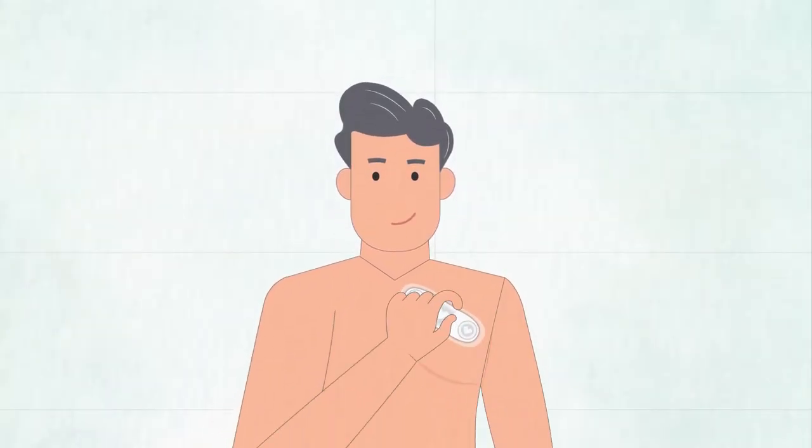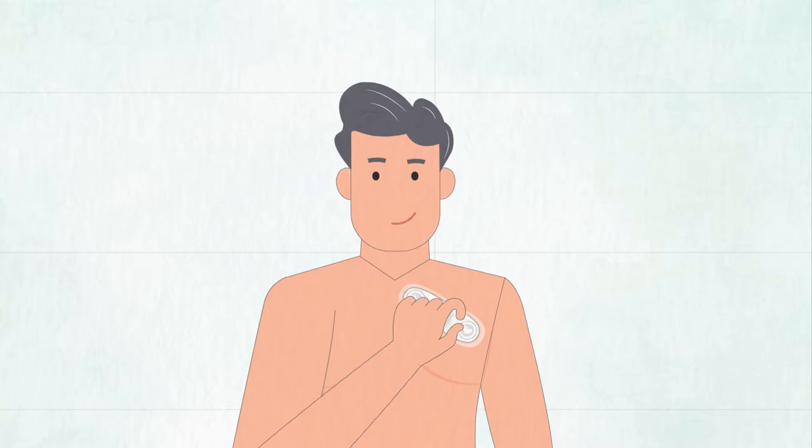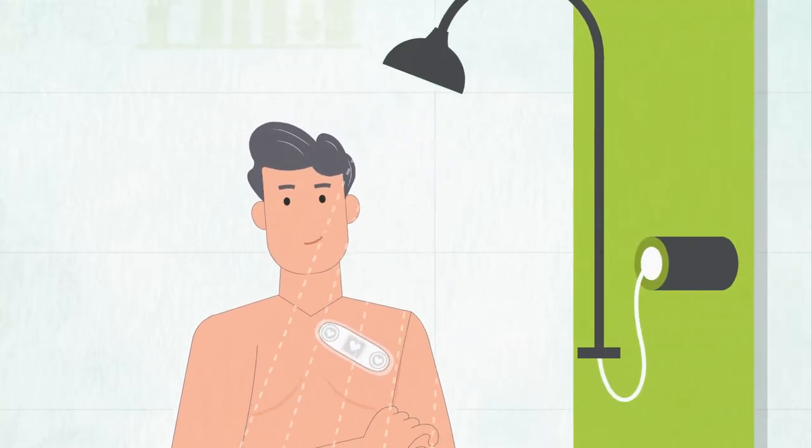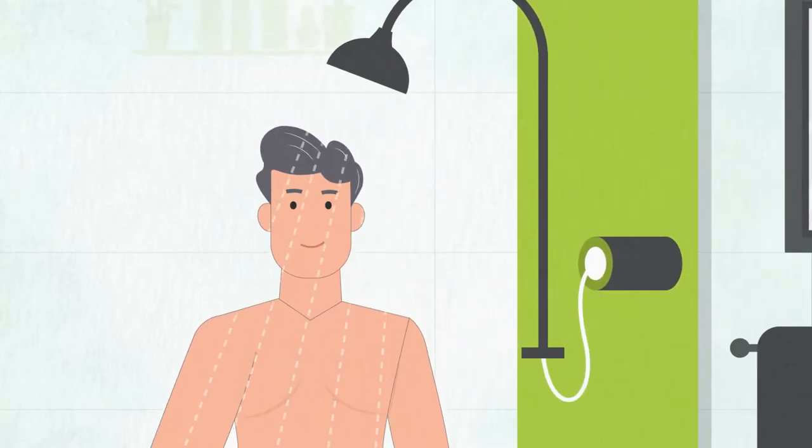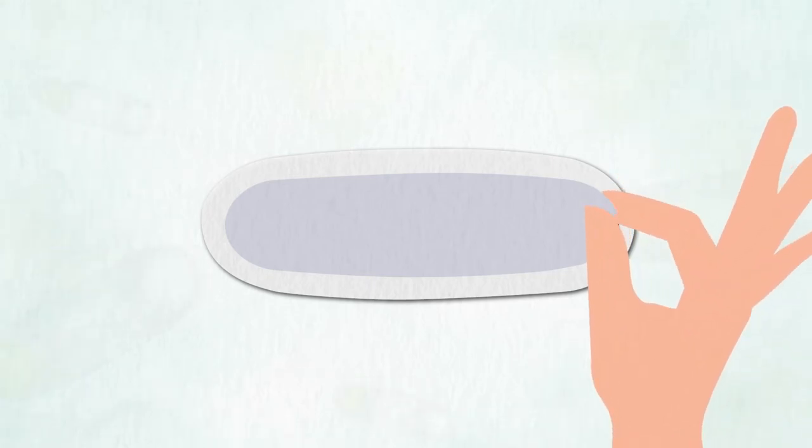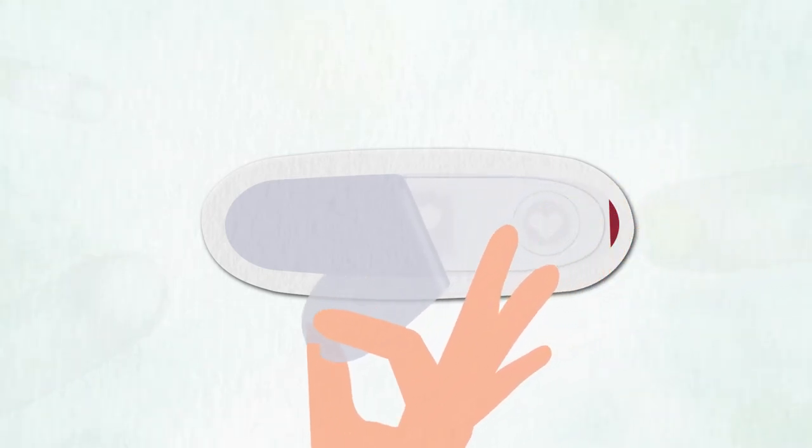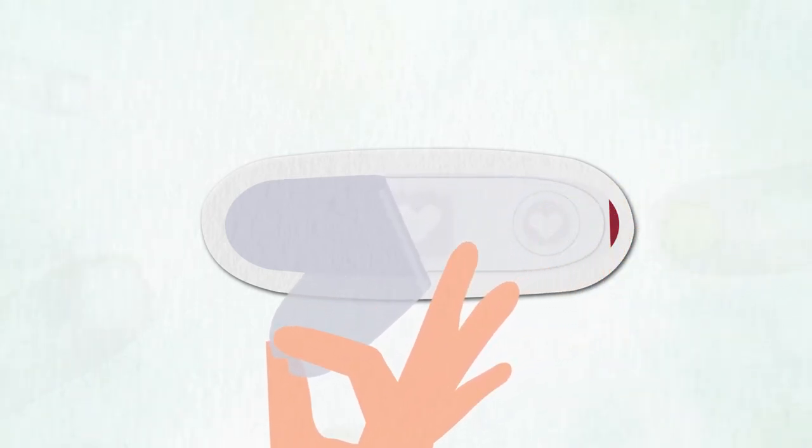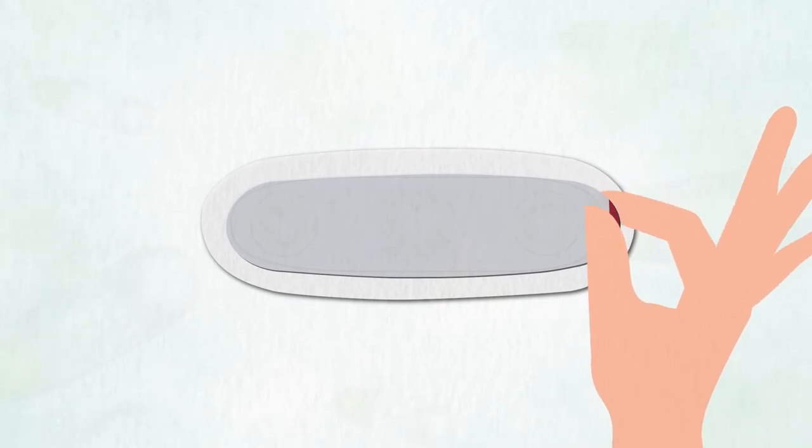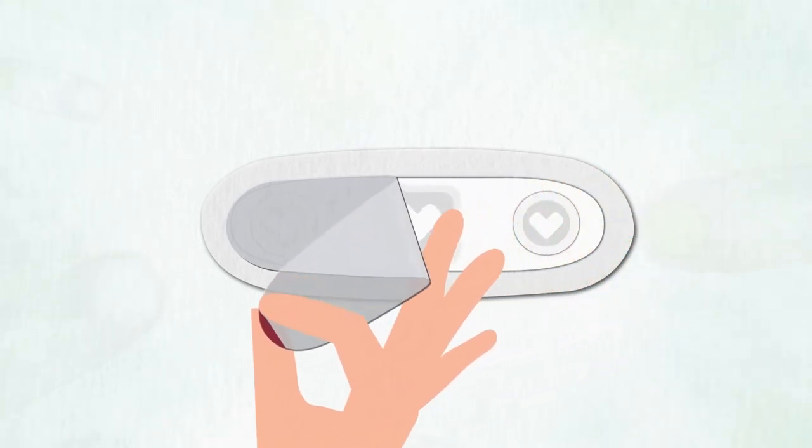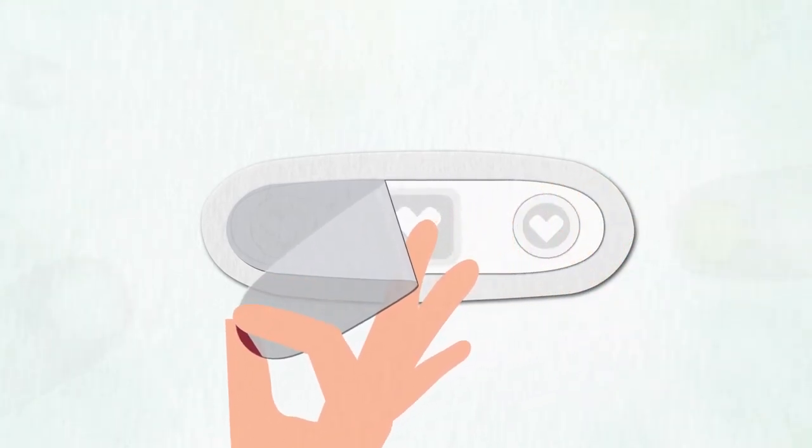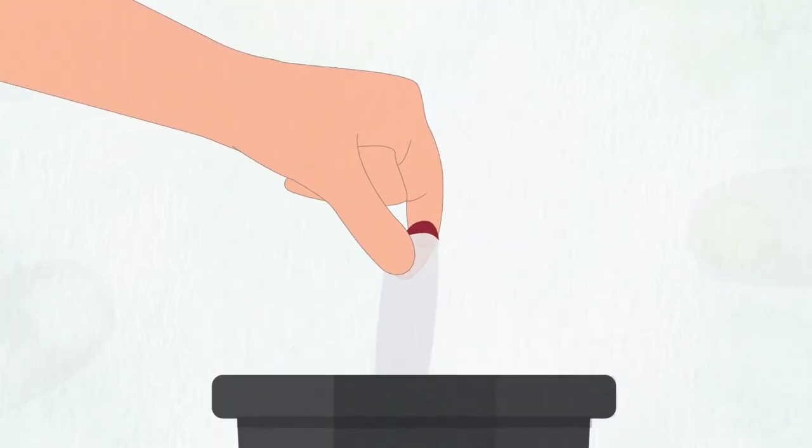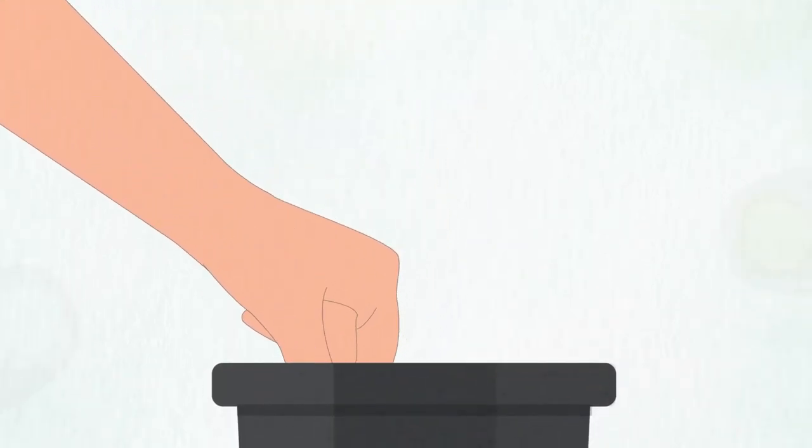To charge the sensor, remove the adhesive from your chest. If you have trouble, try removing the adhesive in a shower. Once the adhesive is off of your chest, peel it away from the sensor. There is a small red tab that can be used to pull away the adhesive from the sensor. Throw the red tab adhesive in the trash once done.